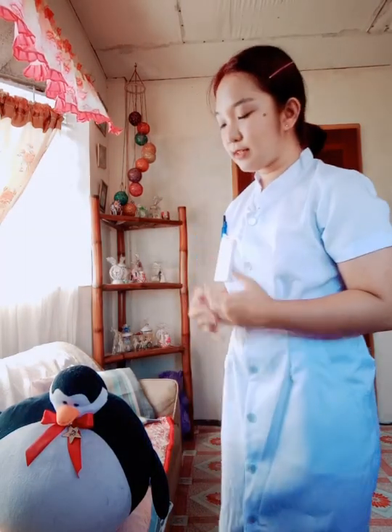to be used. In some cases, we can encounter different patients: child, adult, infant, as well as some stubborn patients. So in this case, it is important to know the size of the needle to be used. The last step in assessing the client is to check for the patient's willingness and ability to cooperate. We can start a conversation with them so that we can understand their side.